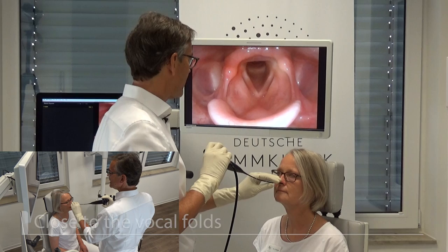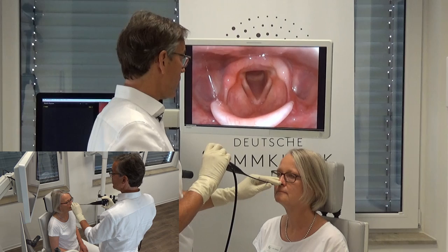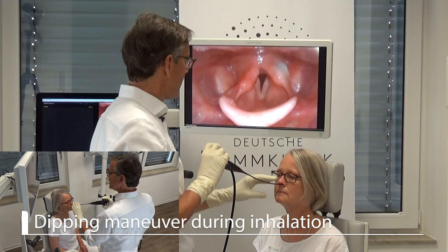Some patients do not tolerate that, so I have to make a maneuver which we call the dipping maneuver. That means that while she is inhaling I will go in, dip in, look, and go out again. I do that during her inhalation, so I first ask her to exhale through the mouth, and now breathe in through the nose. I dip in and go back out.